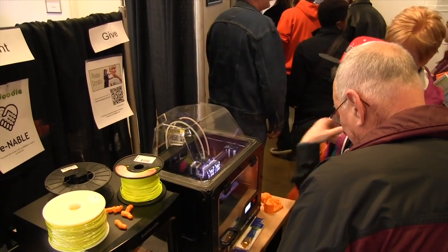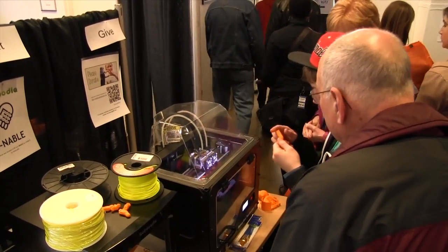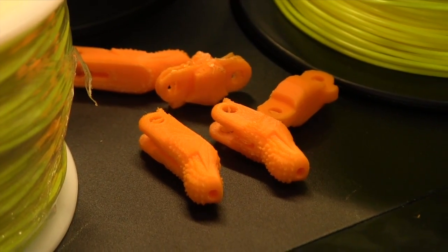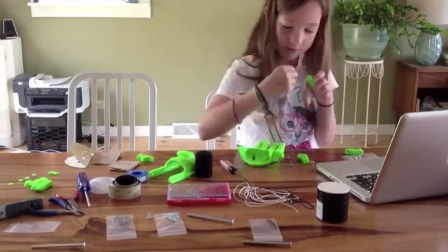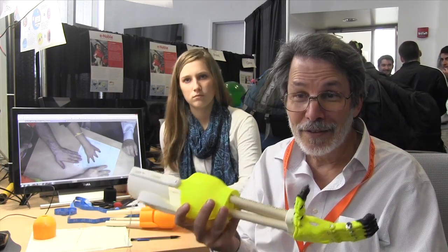And this is an experimental RIT arm design. Once you choose the features that you want, it goes off to the printer, and about three hours later it comes out of the printer. Then there's a couple of hours of assembly, but we're working on easy assembly options, and the next thing you know you've changed a life.